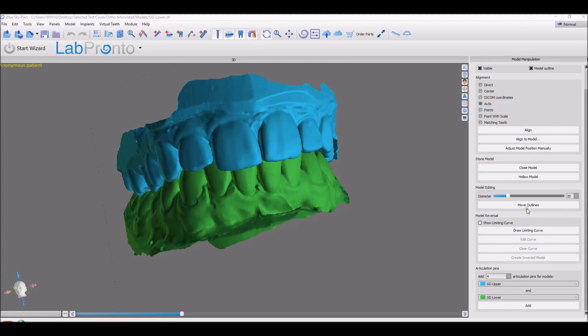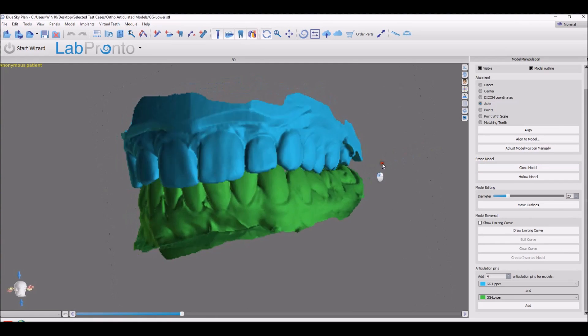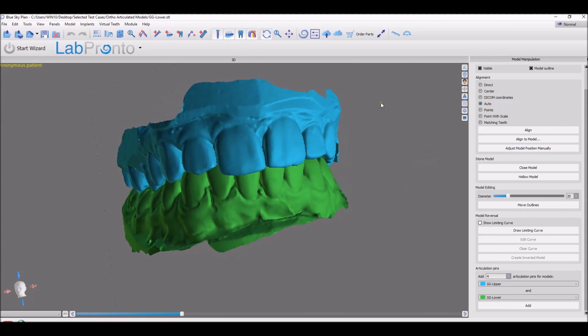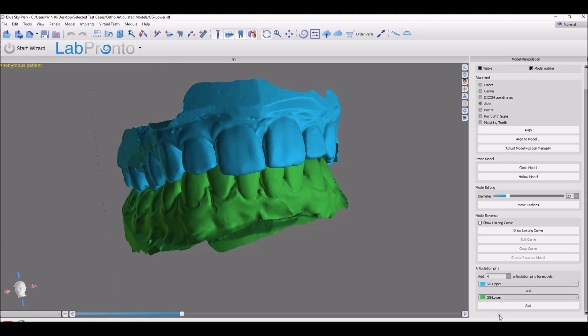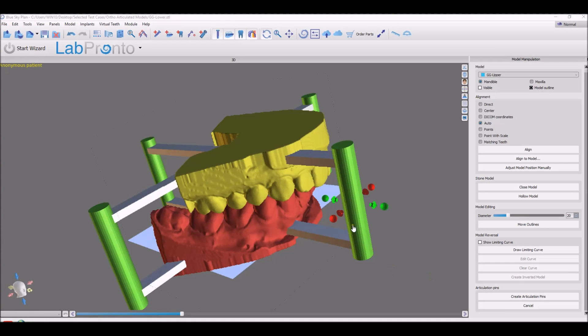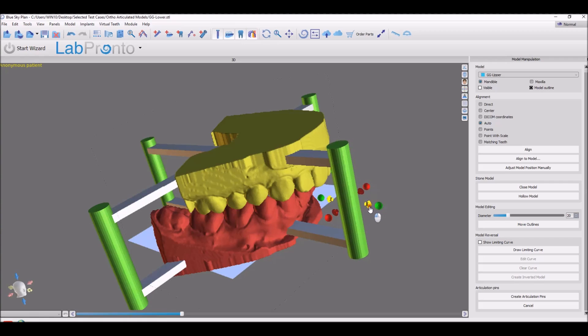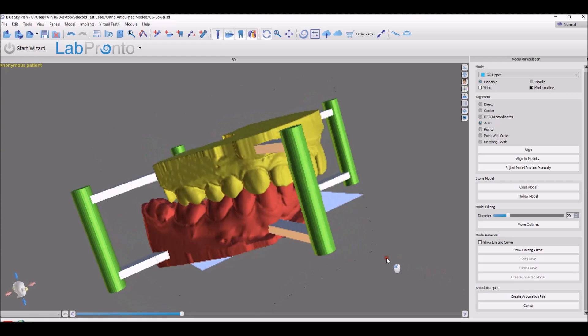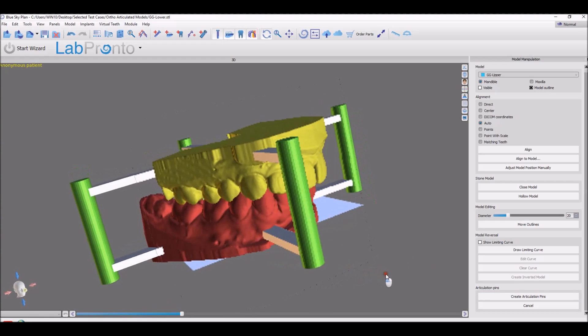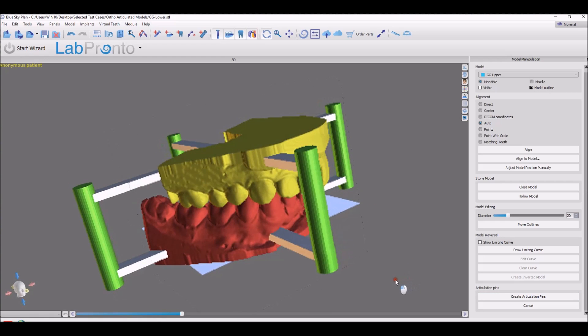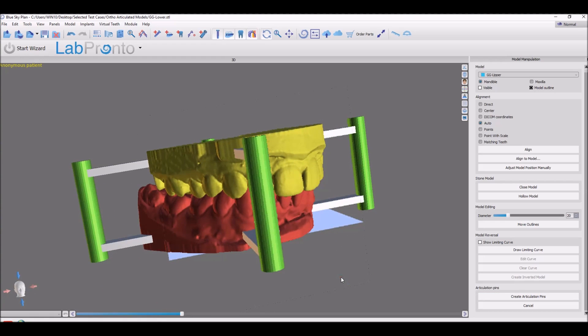We have added articulation pins to the software. So when you have the perfect setup on screen, you can have the perfect setup when they're printed as well. In the model manipulation panel, select the models and click the add button. Use the widgets to modify the placement and the thickness as desired. Click create articulation pins and of course those can be exported attached to the models to recreate the articulation after printing.